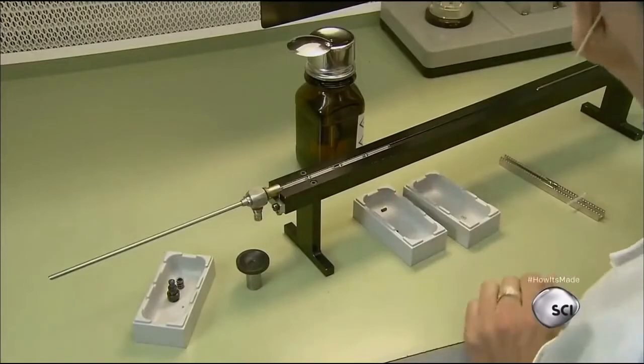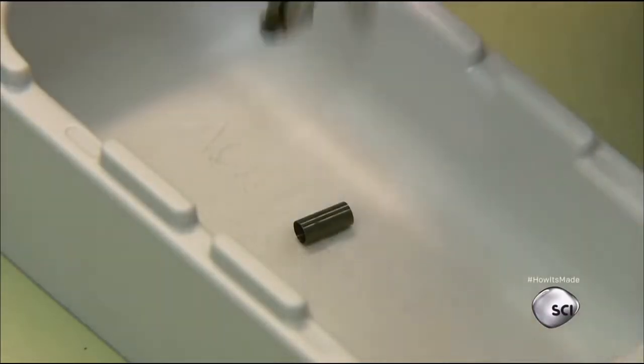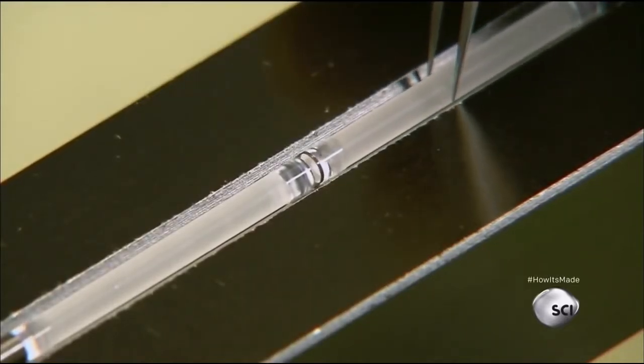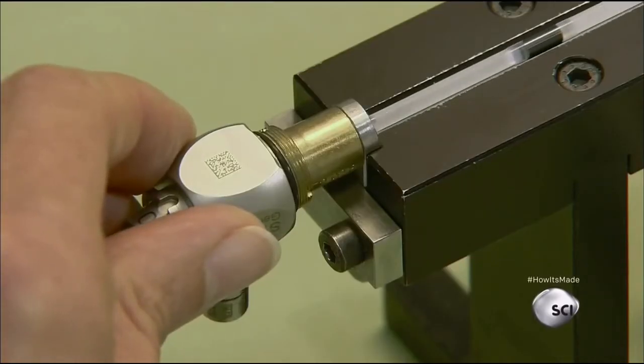The lenses in the endoscope are glass rods. After cleaning them with a chemical solution, workers line them up in a fixture with brass spacers of various lengths in between. Depending on the length of the endoscope, there are 5 to 7 lenses. The spacers create specific distances between them.